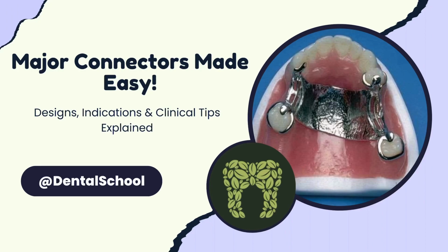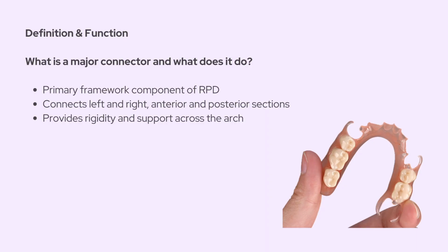So today we're diving into a really fundamental and important topic in removable partial dentures, and that's major connectors. Whether you're designing a Kennedy Class 1 or a Class 3 case, choosing the right major connector is absolutely essential for the success of your prosthesis. So let's take our time today and go through everything you need to know: what they are, their function, the design principles, and of course the different types for both the maxillary and mandibular arches.